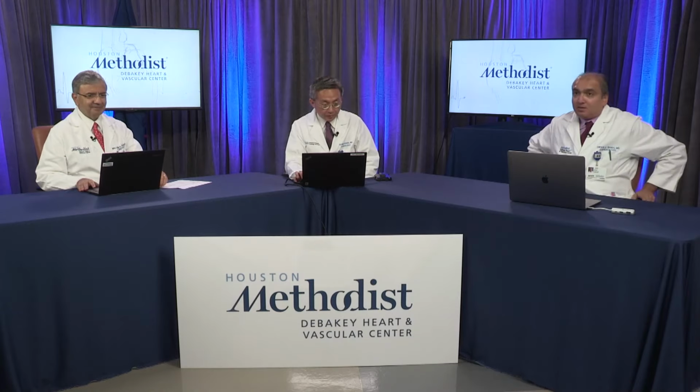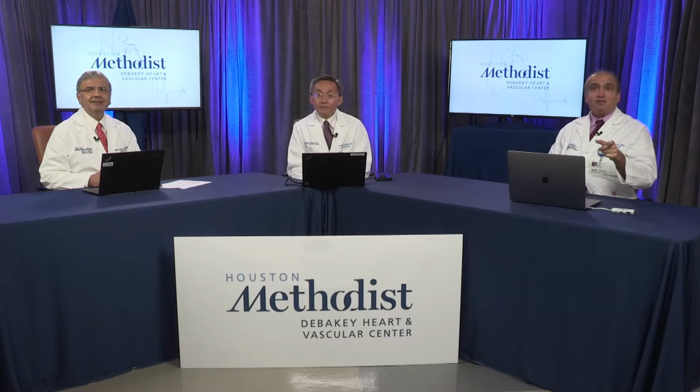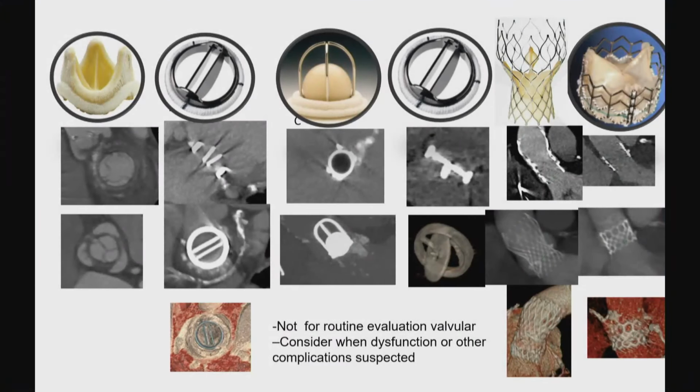Good afternoon. Okay, this is what we can see with CT, different type of valve. Are you on? I don't see you there. Get back. Great.